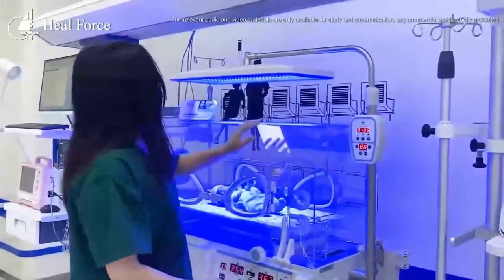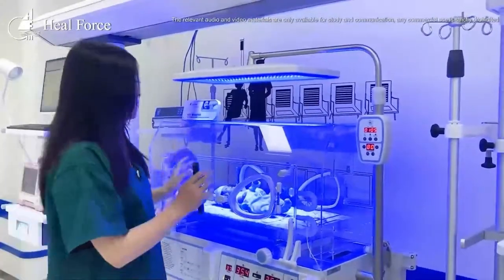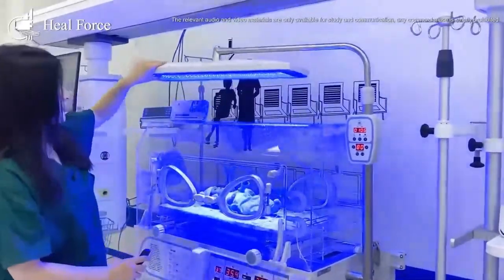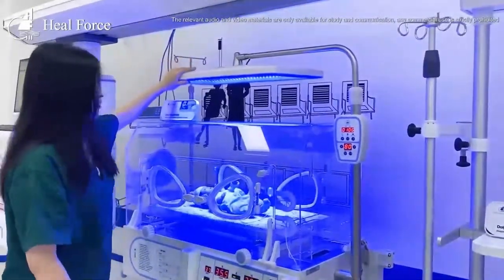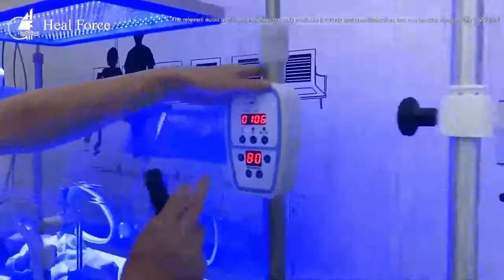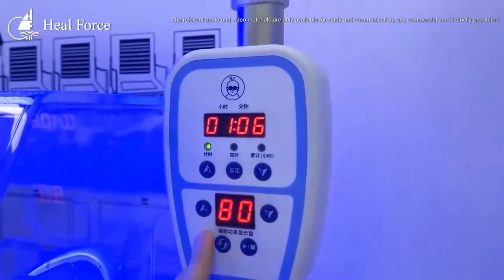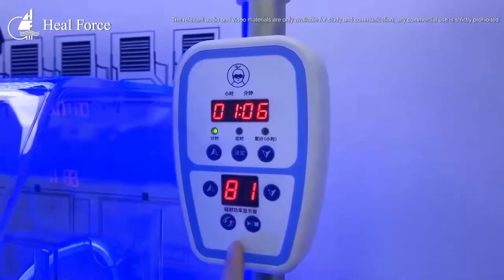This is how our incubator works. If you want to treat a baby for jaundice, you can also select the optional phototherapy equipment. This phototherapy equipment inserts into the incubator and can be separately controlled, allowing you to set a timer and adjust the illumination.